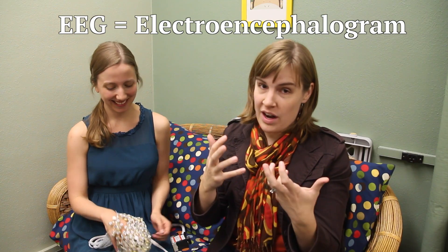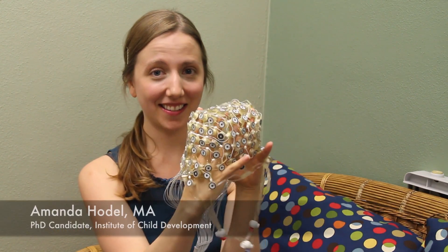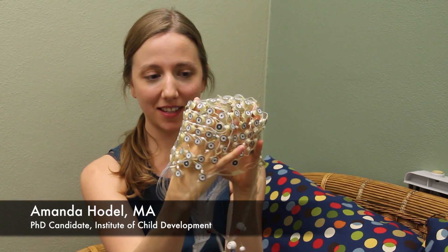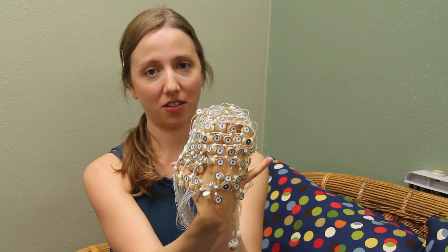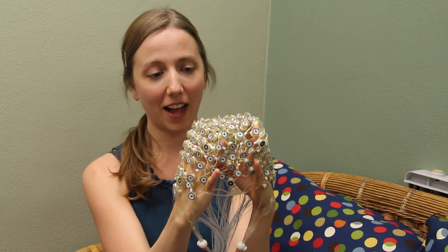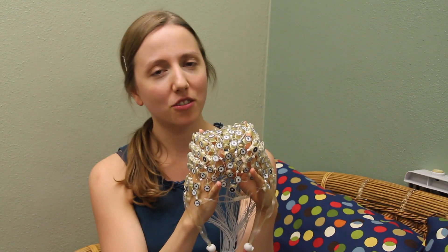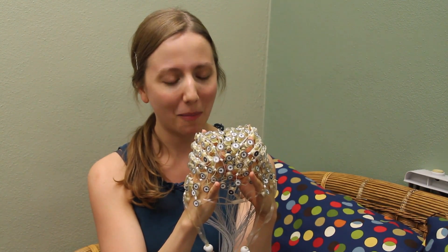So this is where you put a cap-looking thing on infants' and kids' heads. This is an EEG cap — it's a net of a bunch of different sensors. All of the circular parts on here are sensors that can record the electrical activity in the brain. You wear it over your head just like a swim cap, and it actually feels pretty similar to a swim cap.